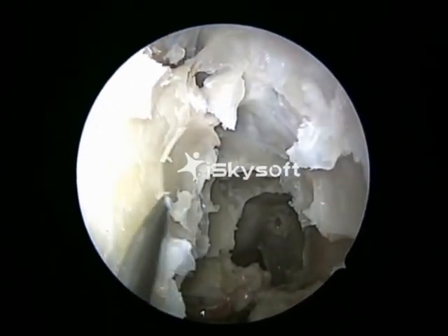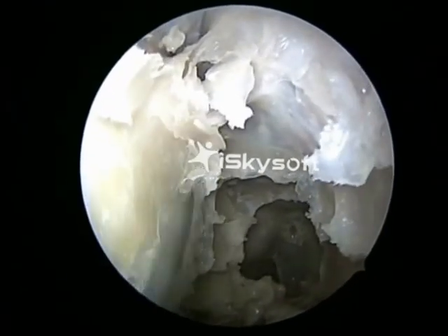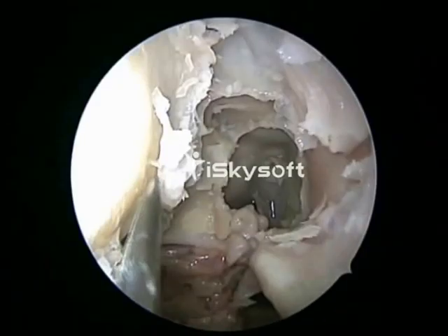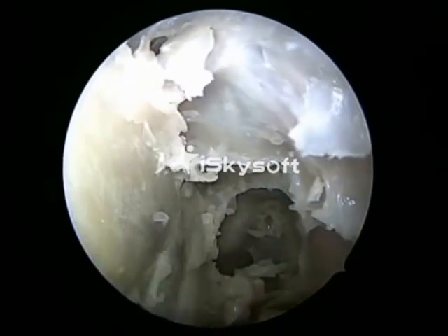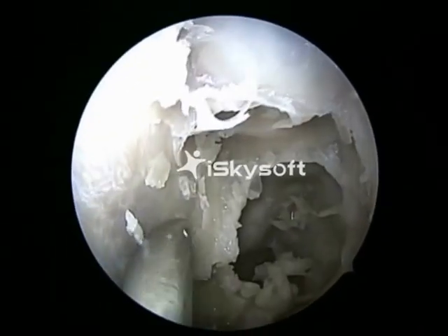It has to be removed 5 millimeters below the level of the frontal ostium, because once we remove it above, it will obstruct the frontal ostium. The bone is taken from the level 5 millimeters below the frontal ostium till the infraorbital nerve, and this is called 1.5 orbitotomy. And this gives retrogression of 5 millimeters.